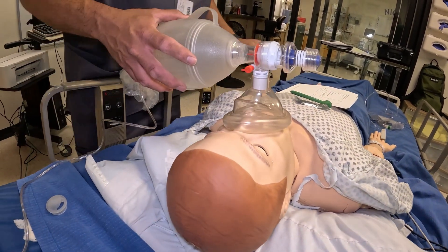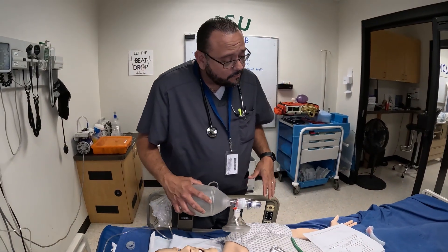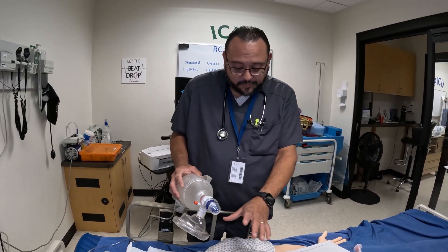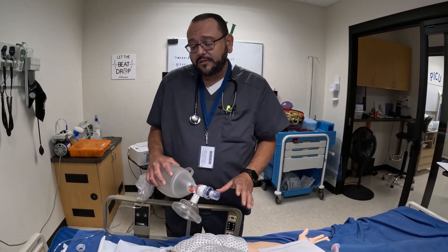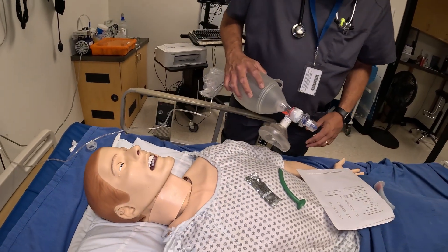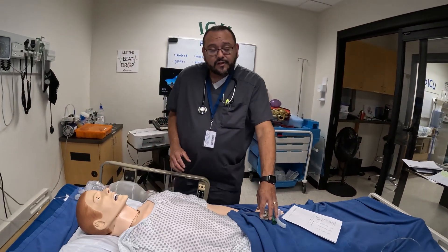After ventilating, be aware of any cyanosis, vomiting, or gastric distension — if the abdomen starts getting bigger, adjust how you're ventilating. If the patient vomits, turn them on their side and use suction to clear the airway. After ventilation is complete, remove the equipment, clean up, and that concludes the competency. Thank you very much.